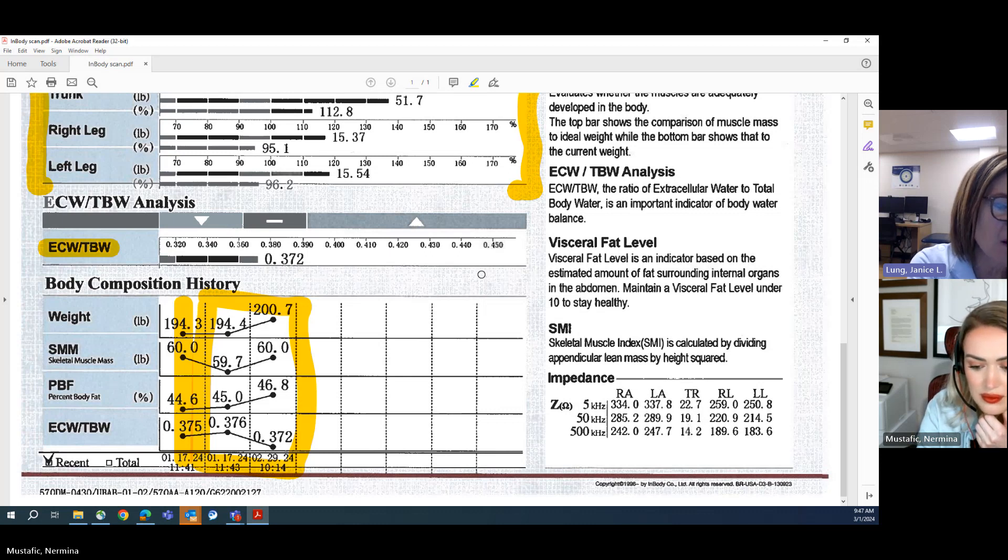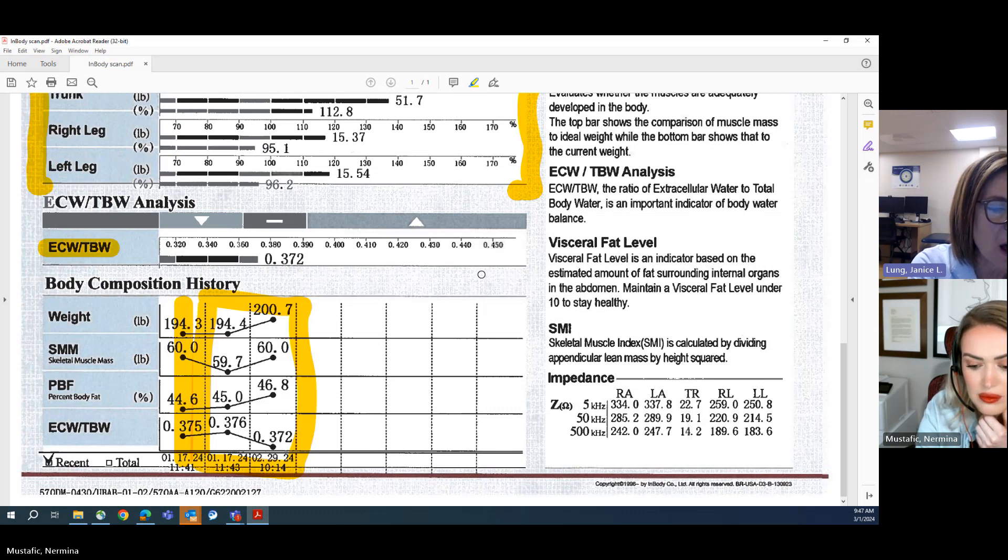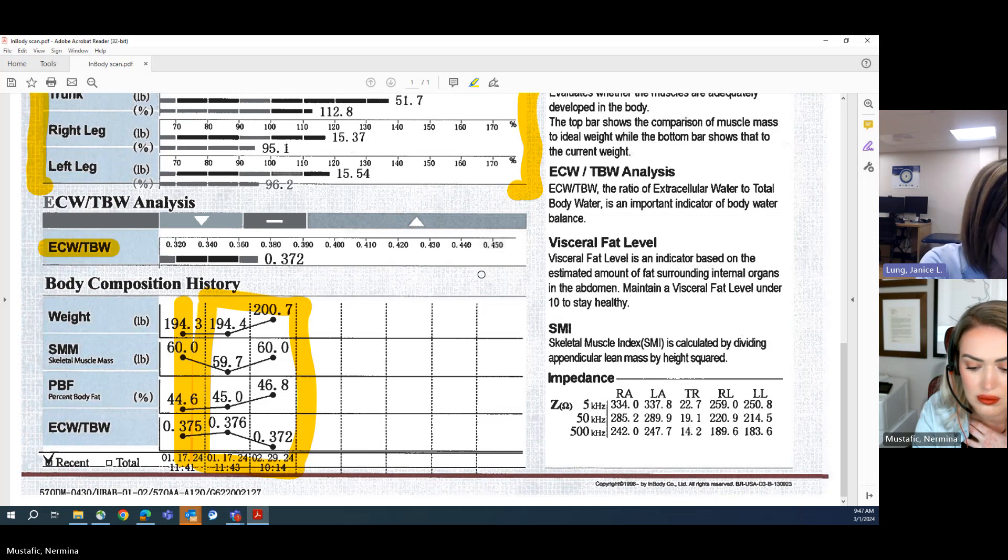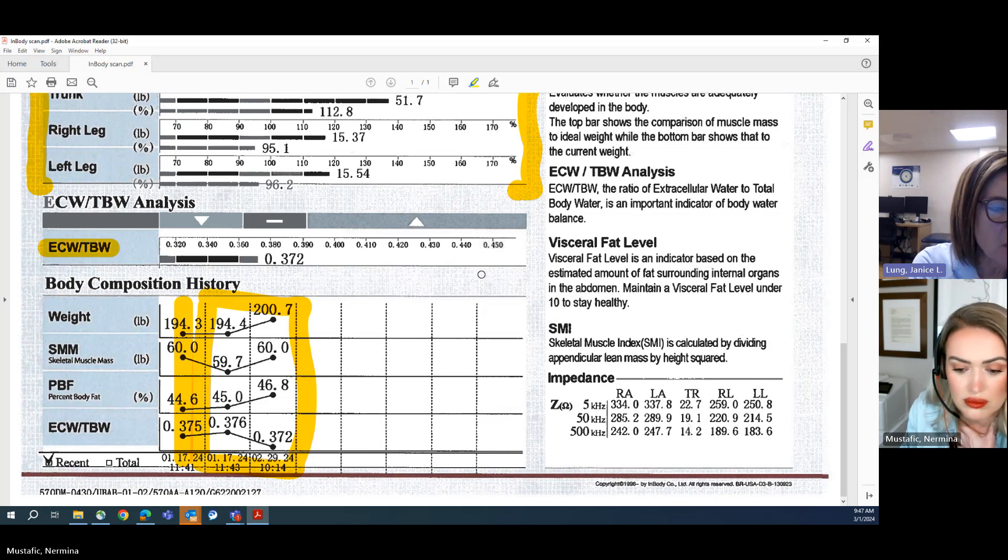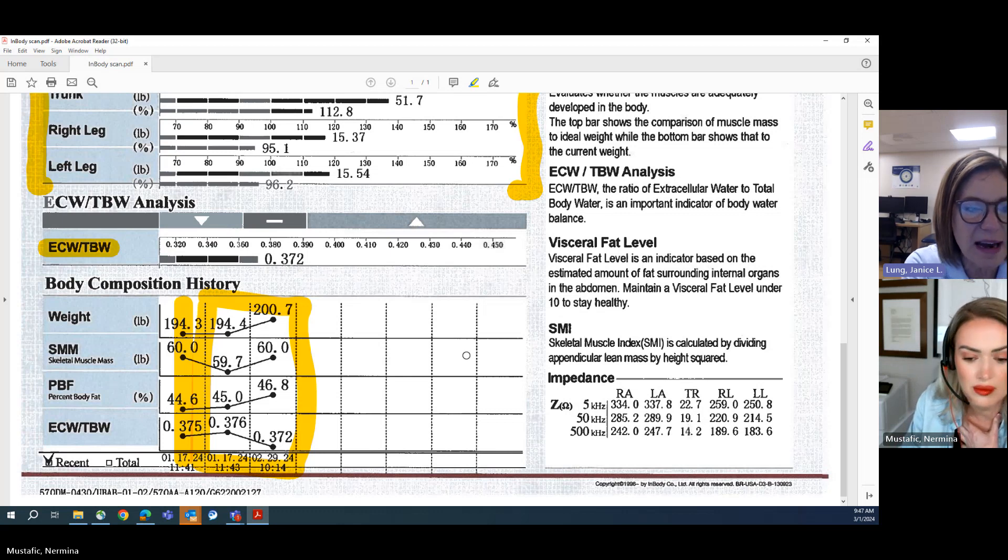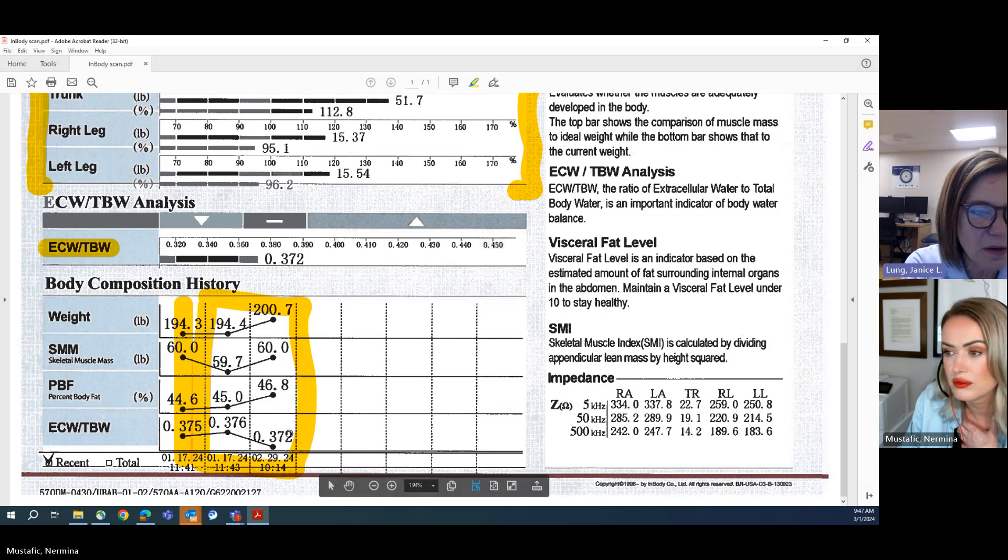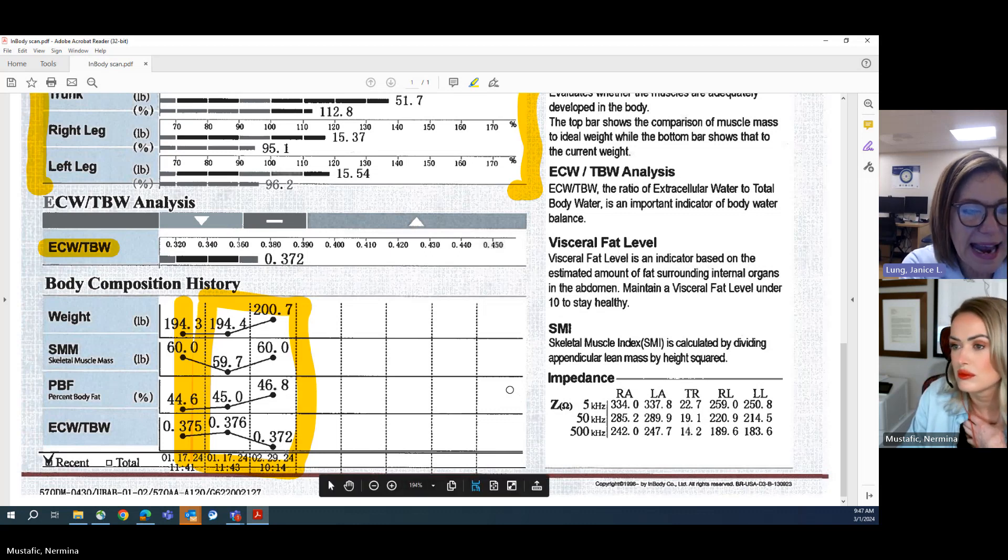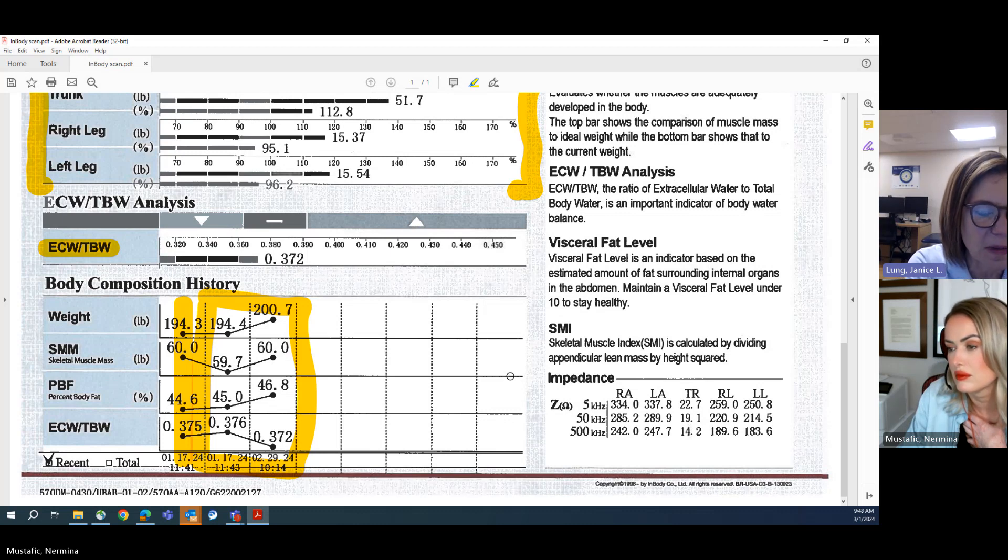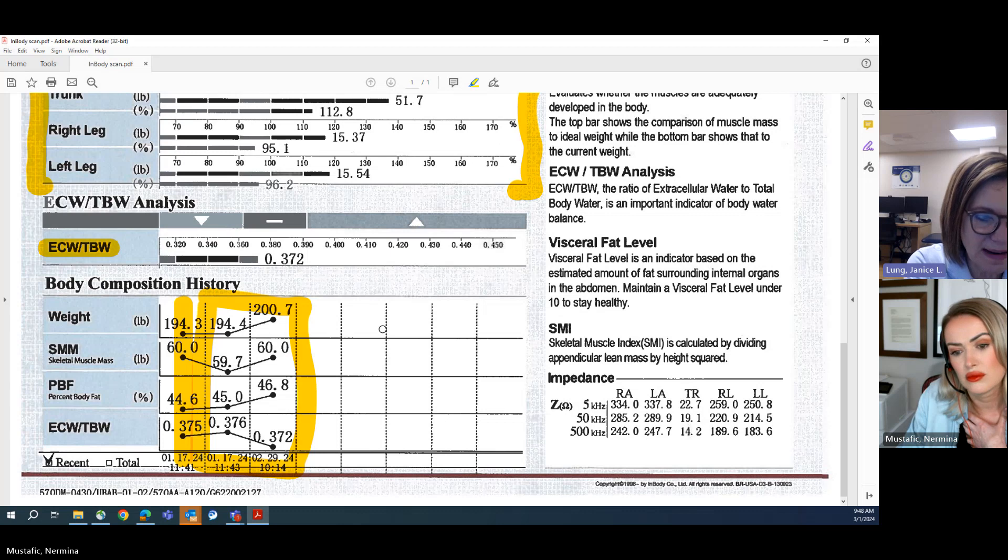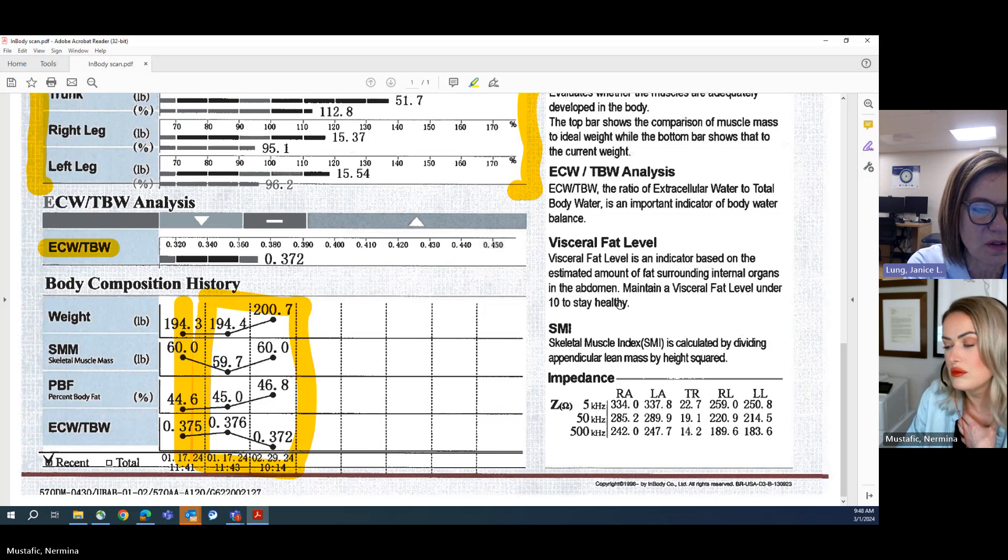What we can see from this is that this particular woman gained weight since January 17th, but she gained a smidgen of muscle mass, but she also must've gained a little bit of fat mass too, because her percentage of body fat came up. And her water ratio came down just a little bit, not really that much. So this is just valuable for this person to see. The more times that she does the InBody, the more data points along the way to see: is she maintaining or losing weight? Is she maintaining or gaining muscle mass so that her percentage of body fat is coming down? So this woman will set a goal to maintain that 60 pounds of muscle mass, bring down her weight, and then she'll see her percentage of body fat continue to fall.